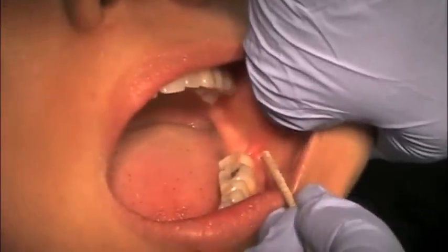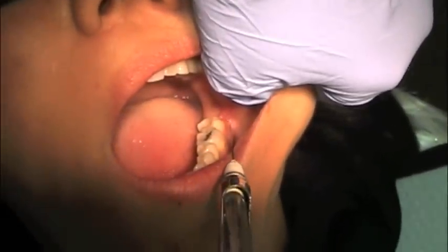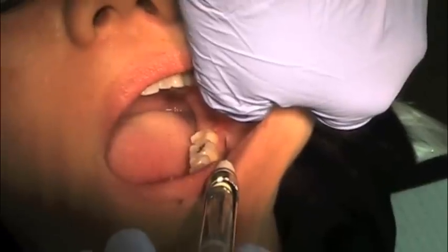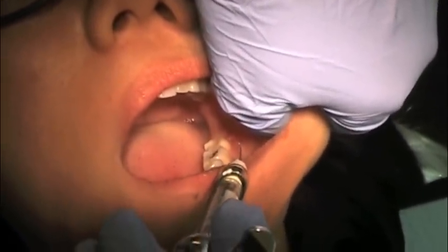The insertion site is at the mucobuccal fold, at the distal of the last molar. Bring the syringe parallel to the occlusal surface of the molars and insert the needle until osseous contact is reached. Depth of insertion is only a few millimeters.